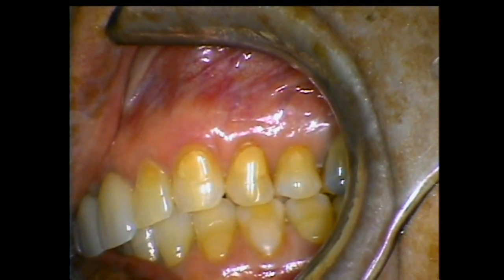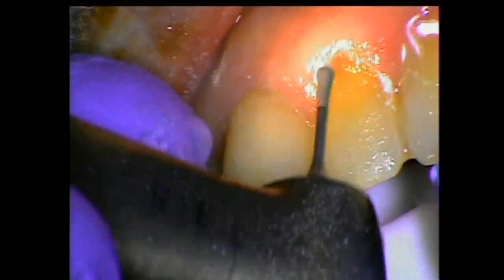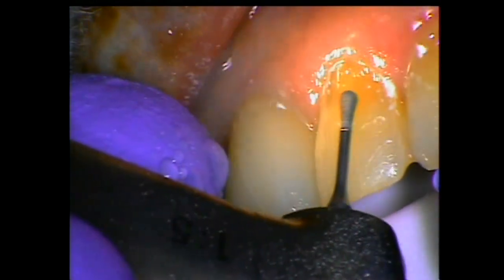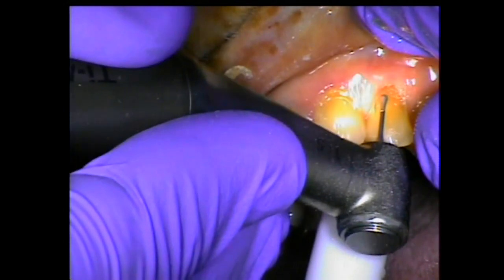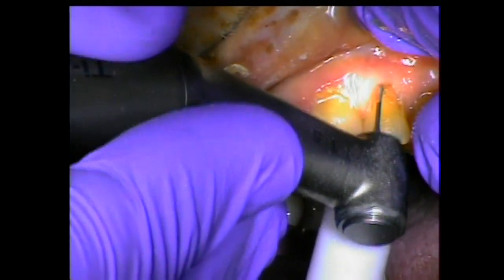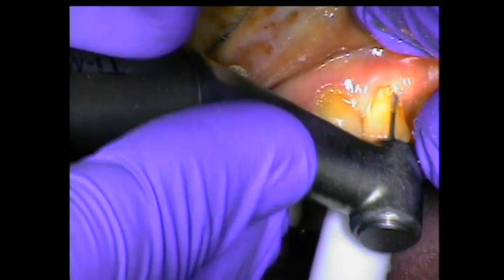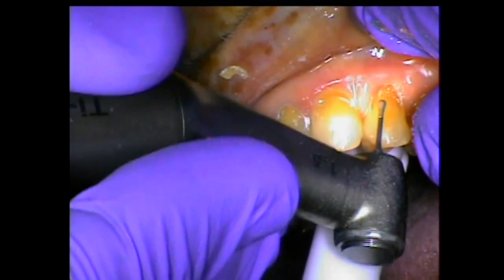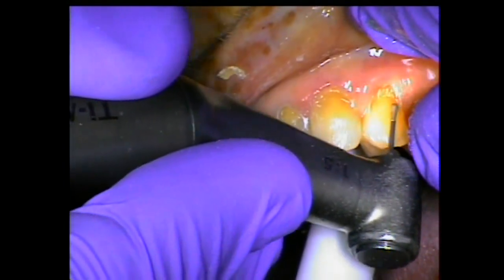It's going to be a relatively simple procedure — this is really easy to do if people understand how to do it. If you get a perfect contour, take it slightly beneath the straight margin of the gingival tissue, and you get a perfect blend of the restoration of tooth surface. So the preparation is very important.